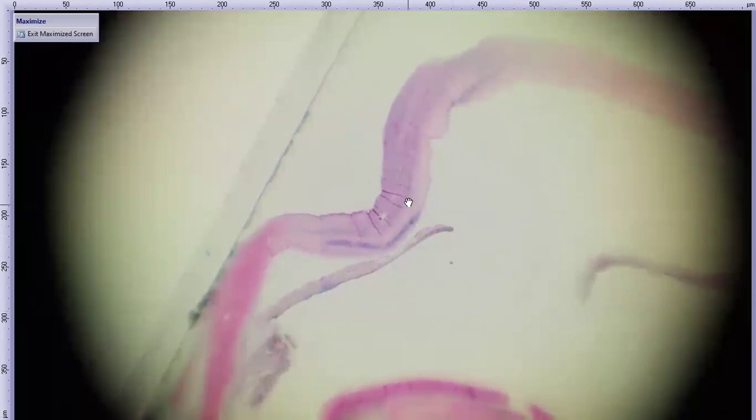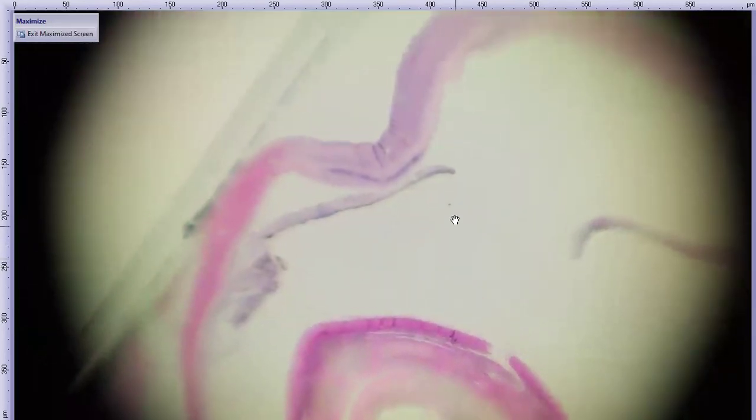So cornea up here at the top, we can see it's pretty hypercellular here, lots of extra cells there. Here's our iris leaflets, lens, and as we head towards back, you notice that there's actually pretty marked cupping of the optic nerve head, which is not normal in cats. Usually we associate that with glaucoma, which they said no to. So we will look at that a little bit more closely.